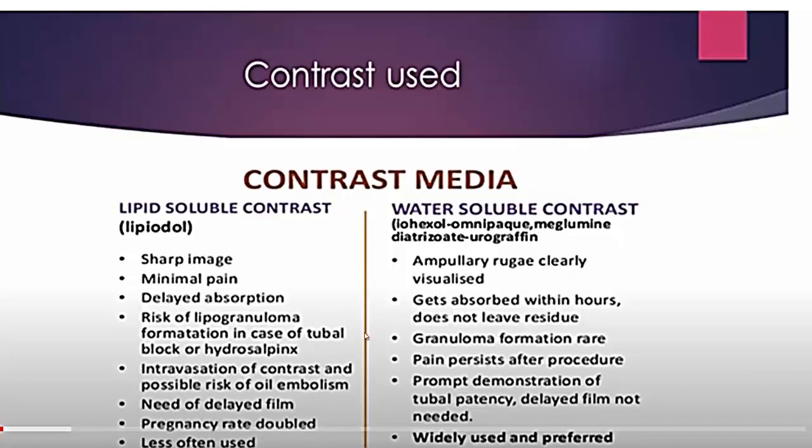This slide I used to put, but nowadays we don't use lipid-soluble contrast, here in Egypt especially. It's not so much available. But long ago, the gynecologists usually needed lipiodol, because they say that it has a therapeutic effect rather than the water-soluble contrast.